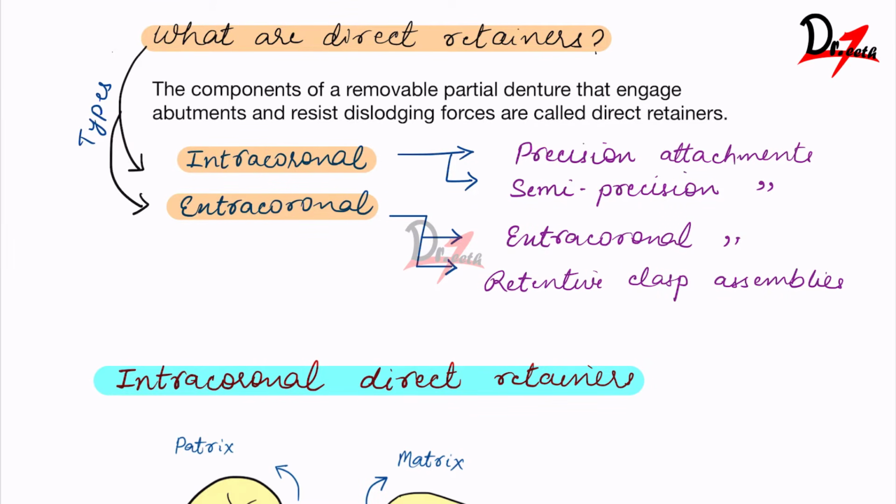Today we are going to learn about the direct retainers in the cast partial dentures or the removable partial denture.